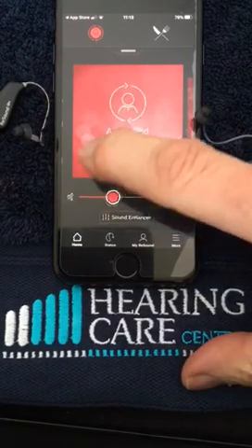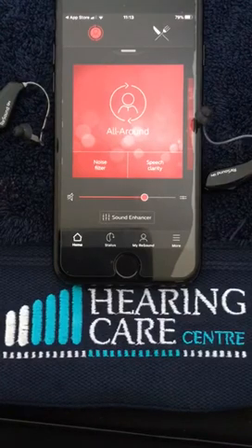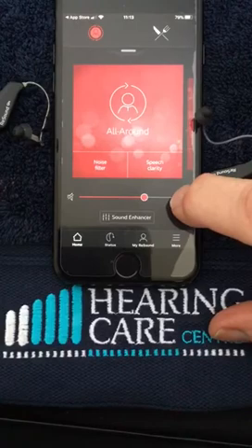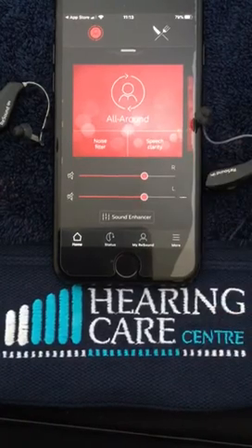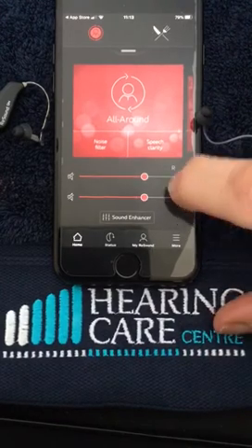We've got a volume control here that we're able to alter, in addition to the buttons that are on the back of your hearing aids if they are set. We can also split the hearing aids so we can turn the right or left up or down independently, but we advise to keep them together.